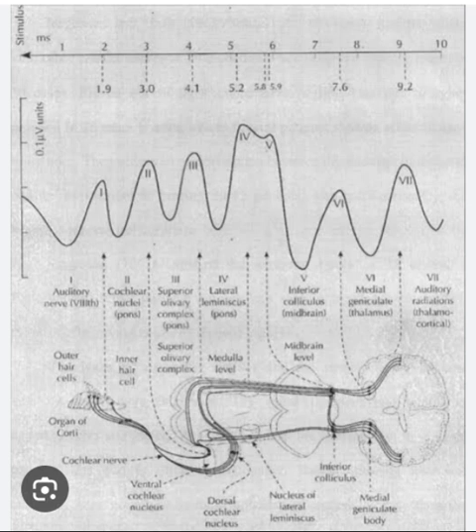The amplitude of BAER is measured from the peak of wave V to the trough that immediately follows and is present at a latency of about 10 milliseconds. The amplitude generally ranges between 0.1 microvolts and 1 microvolt. A threshold of 0.04 microvolts is commonly used as the minimal cutoff to determine the presence or absence of waveform V. The amplitude should correlate directly with stimulus intensity, i.e., louder stimulus intensity leading to larger wave amplitudes and vice versa.